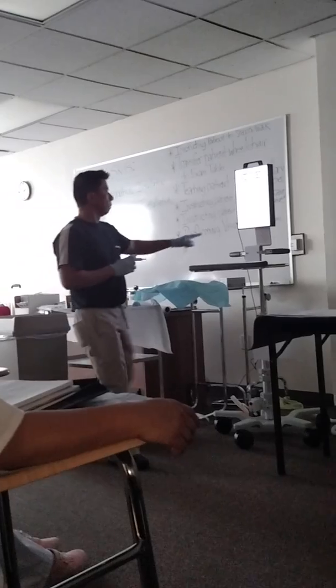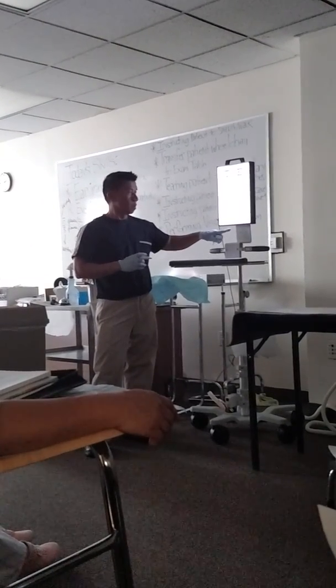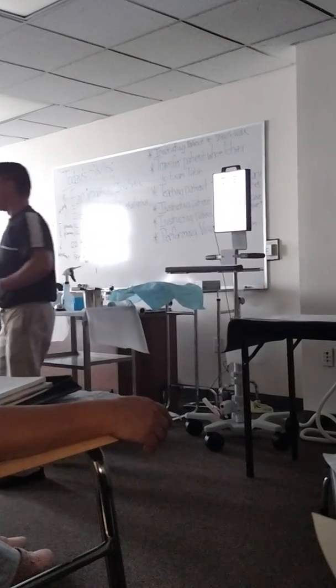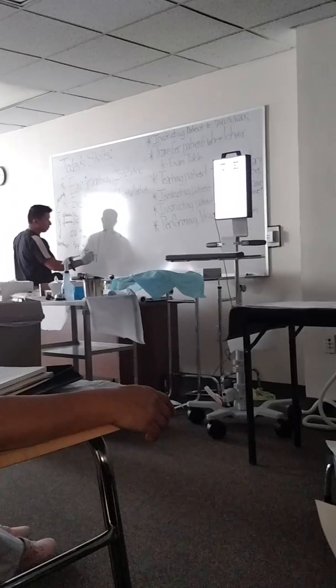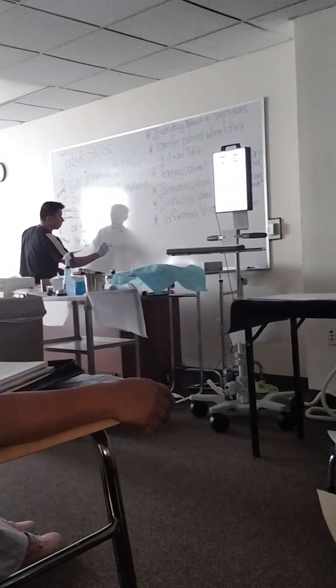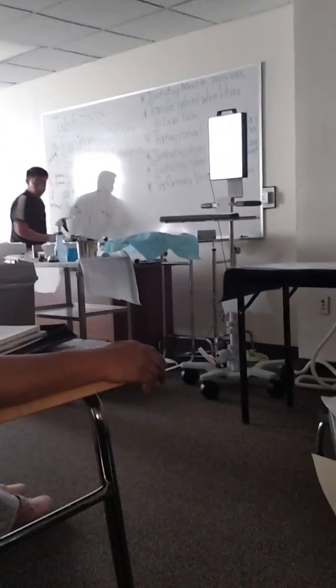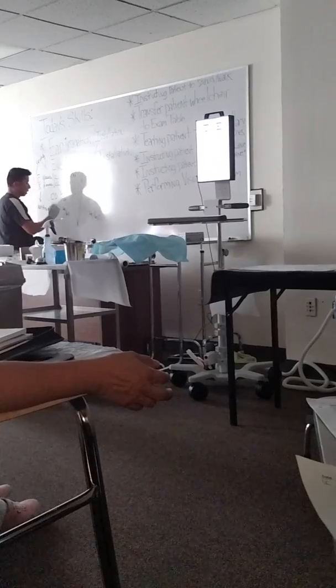Tell me which line you can read. Bottom. F P C D T Z L E. Very good. Okay. So, it looks like his left eye without the pinholes is 20 over what? 60, yes? And with the pinholes down, is 20 over 15. Same thing with the other side.